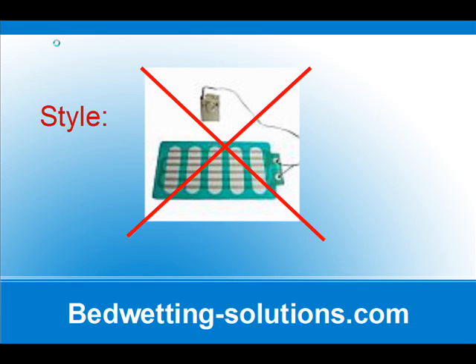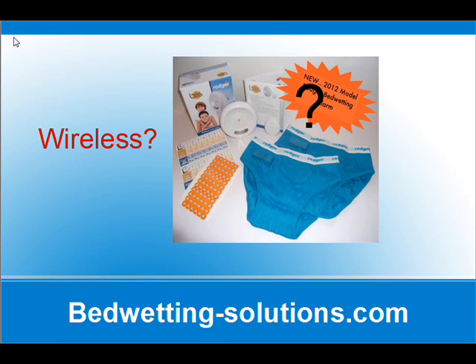Next, you might assume that wireless units are superior because they're expensive. Not necessarily so. The alarm is used initially to wake the parents, but after a week or so it wakes the child. Unless your room is really distant from the child's room, then most will be perfectly adequate for you. If your room is distant, then you might use a baby monitor at the same time. And don't worry about the alarm waking other children. They won't even hear it.